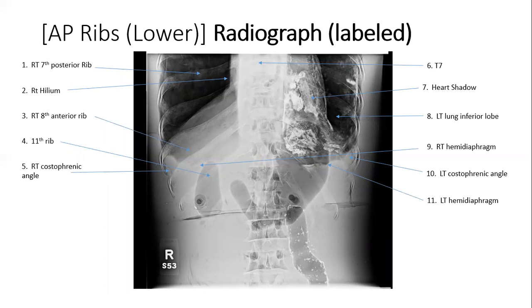All that is how we will position our patients for our AP ribs lower segment and what is needed to be able to get our good image.